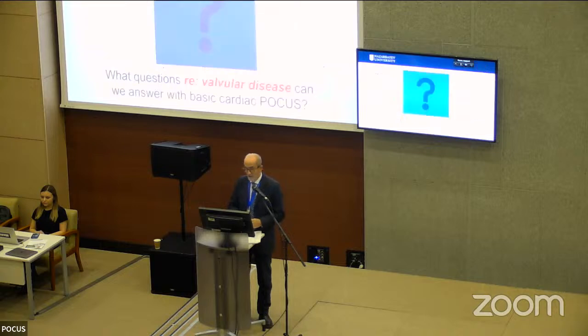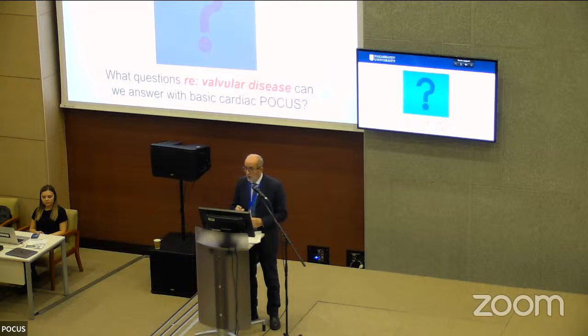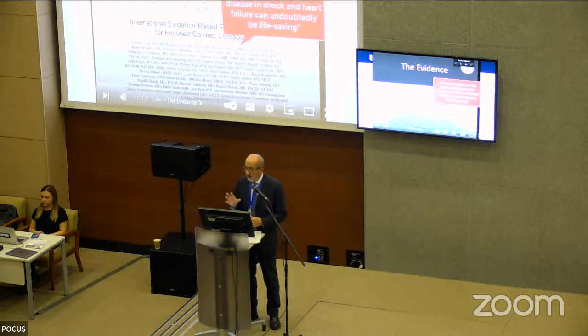Okay, so the question is about valvular disease. What can be answered by using the basic cardiac POCUS? And the evidence is still here because, for example, in this article on the POCUS ultrasound, there is a clear statement about the role of severe valvular disease in shock and in heart failure that can be assessed by point-of-care ultrasound with an impact in life-saving.